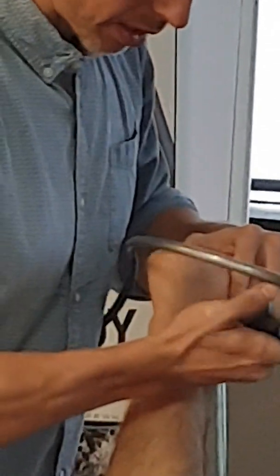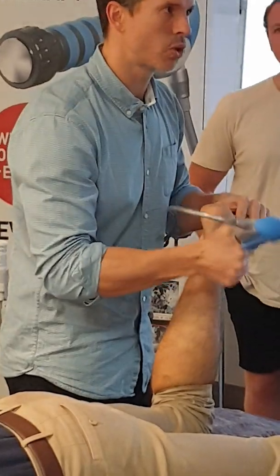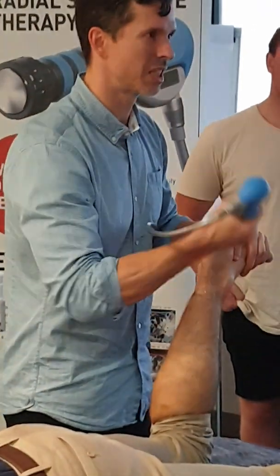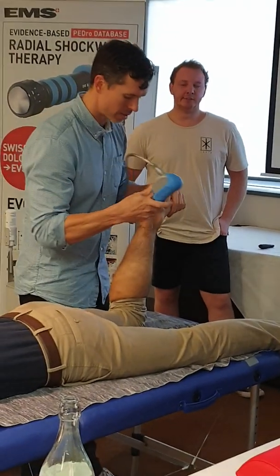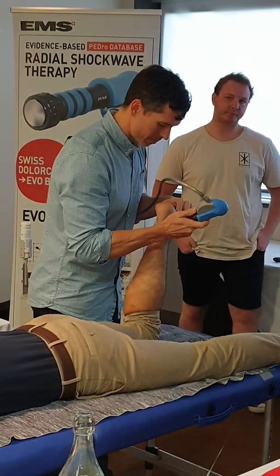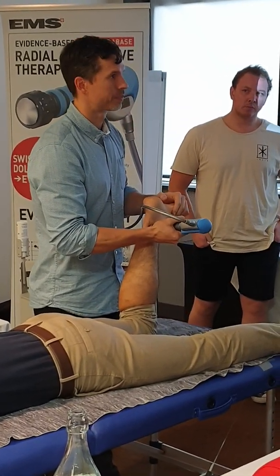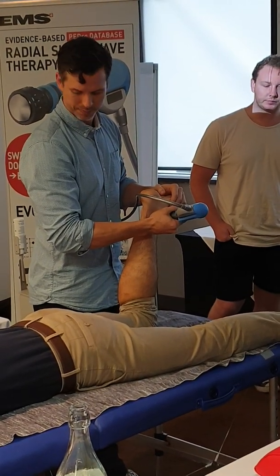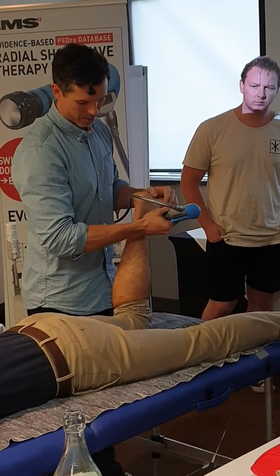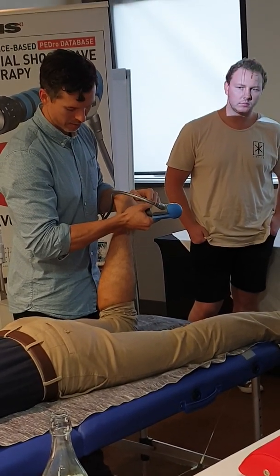So I'm doing the ironing here. The beauty with the 15 mil is it just sits in that groove so perfectly. You just sit in that kind of rut in there, and you just go up and down, up and down. Now you can just hold it there, okay? You feel that? Yeah, it's not too bad. Probably might do a bit higher or lower. Yeah, there we go.